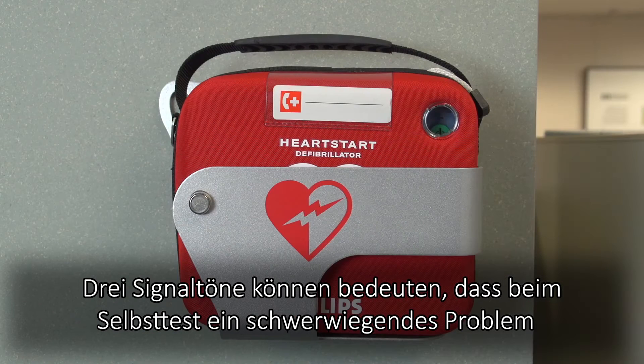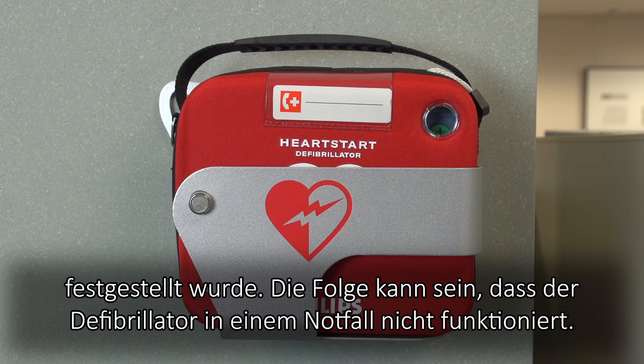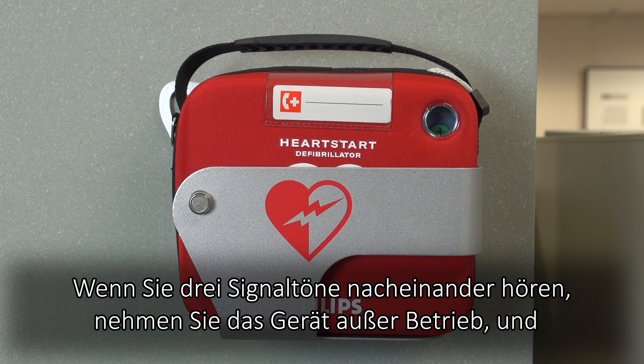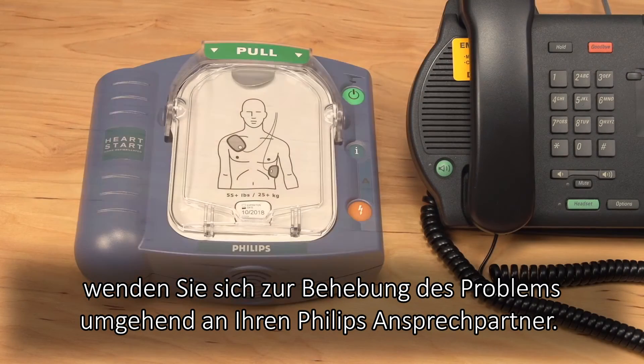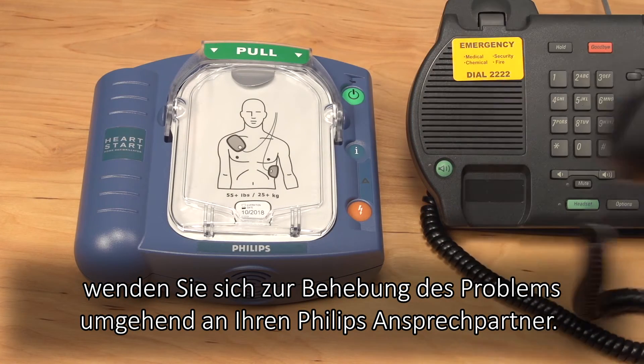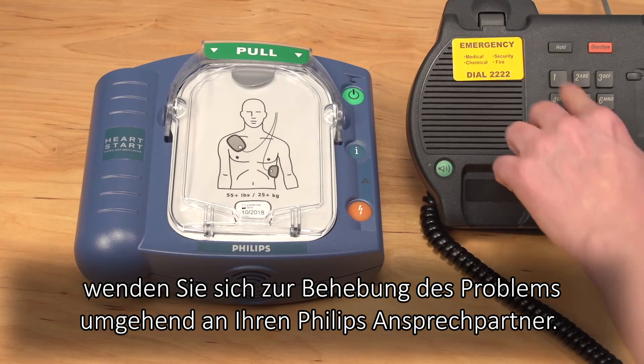Triple chirps could mean that a potentially serious problem was detected during the last self-test that could prevent your defibrillator from delivering therapy in an emergency. When you hear triple chirps, remove the device from service and contact Philips or your Philips representative immediately for technical support.